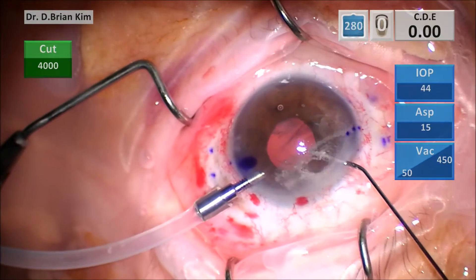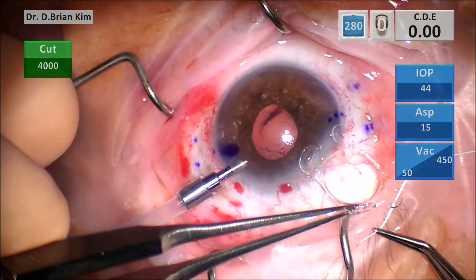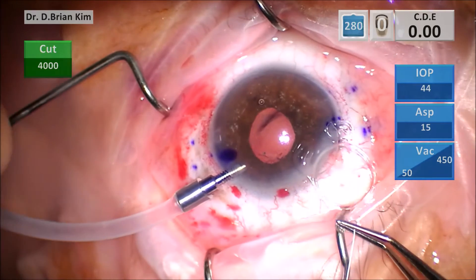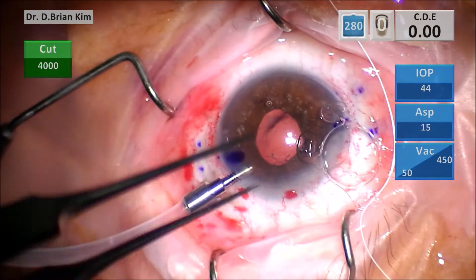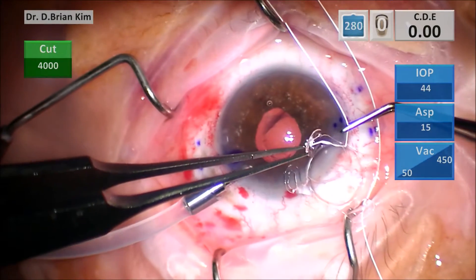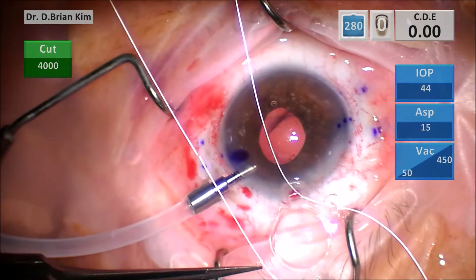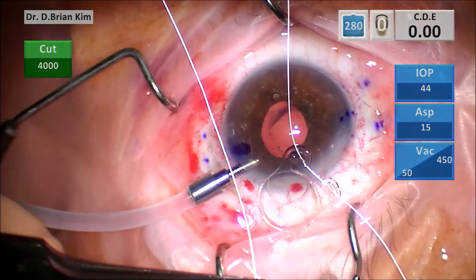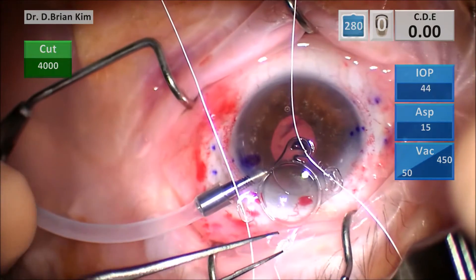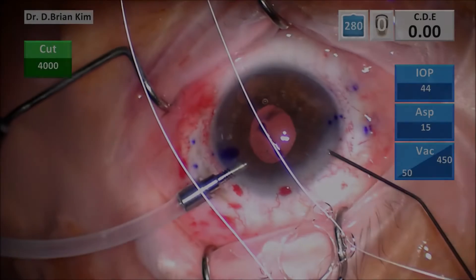I inject some intraocular triamcinolone and triessence to ensure there's no vitreous, and indeed there wasn't. I'm now placing 7-0 Gore-Tex suture onto the Acreos lens. You want to put the suture through the loop from the top, then loop up and under from the other side. You do the same thing again — from the top you loop down through the hole of the loop. Then you take the end of the suture and go back from under and up through the loop, so that you create a sling for the scleral fixation.